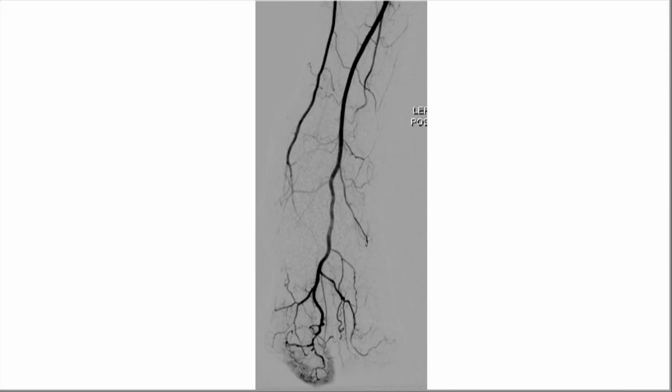On completion, you see a great angiogram. Some people would have left it alone, but that's why we have IVUS and why we have devices like this — to further enhance wound care and prevent the patient from losing their limb, because we know that limb is life.